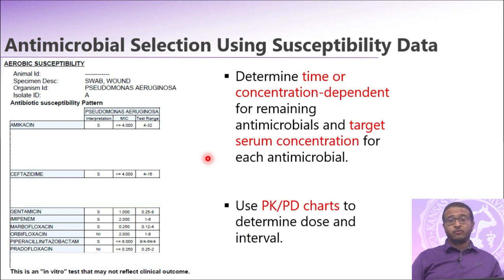And then, if we take all these factors together and try to filter out and narrow down the list of the antimicrobials that we're going to consider for treatment for this specific case, we come up with those options here, right? Those options are based upon the in vitro susceptibility profile that we ran.